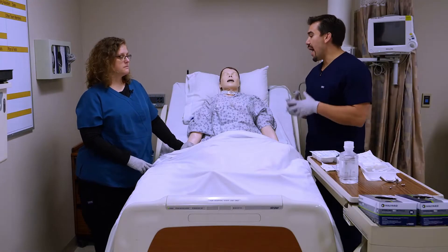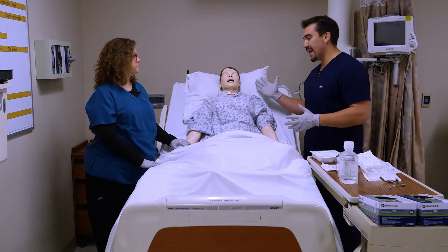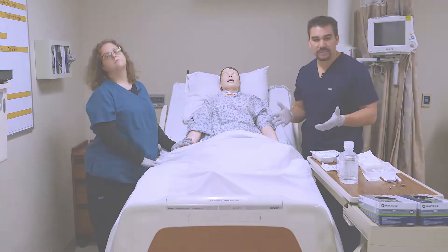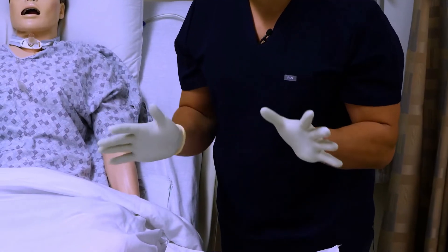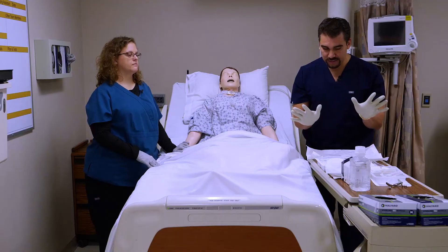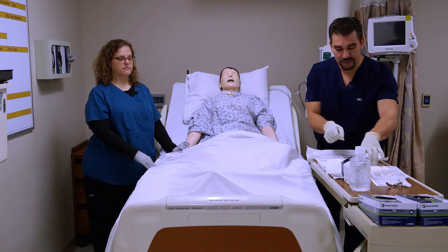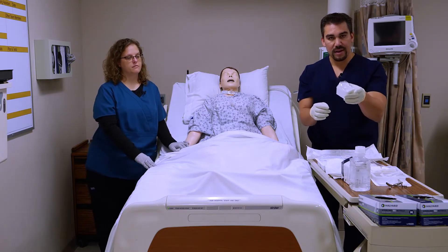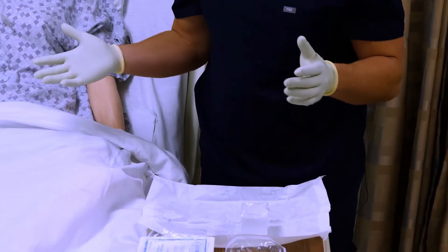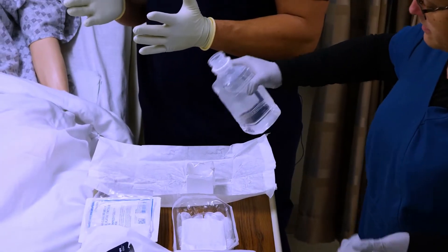When it comes time to suction and change the cannula, we want to make sure the head of the bed is upright and even sitting on one side if necessary. Now that we've donned our sterile gloves, I'm going to keep those alligator arms making sure we're completely sterile. I've opened up our suction kit so everything's sterile in here. I'm going to open up our little water container, and Kat's going to help by pouring. I'm not touching anything in the sterile field.